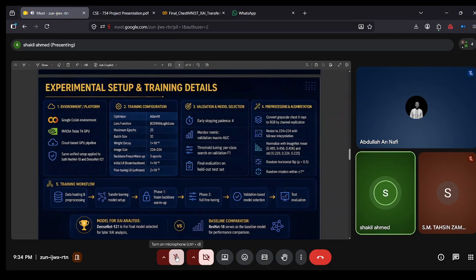For explainability, we use GradCAM and EnsembleCAM. The uniqueness of EnsembleCAM is here. We take the last 5 convolution layers, whereas the traditional approach takes different weak models and aggregates them. Our approach shows significant upward performance when we cross-check with other approaches. Heatmaps produced by this method highlight the important regions of the image that influence the decision of the classifier. For example, if a patient has pneumonia, it will highlight the opaque region of the image to indicate lung infection. That's all from me. Hassan will continue the rest.